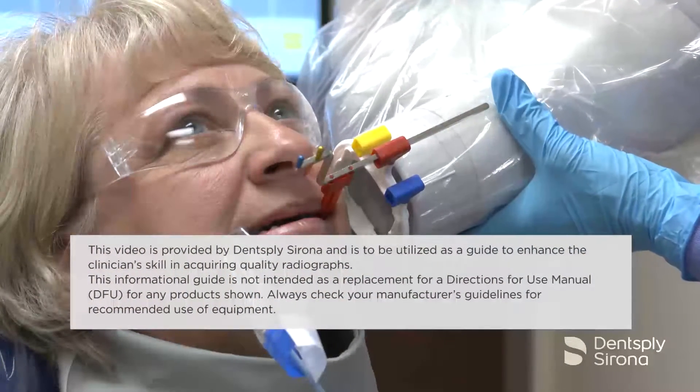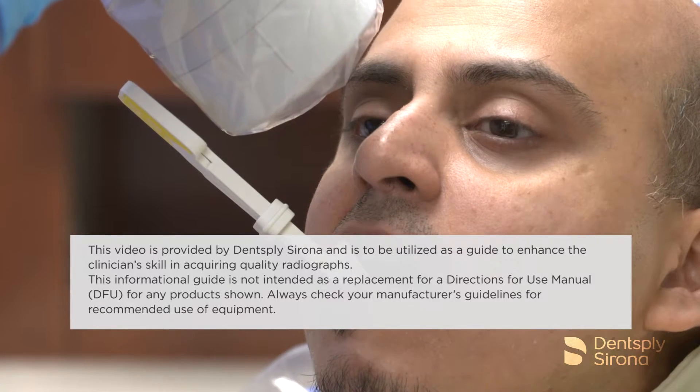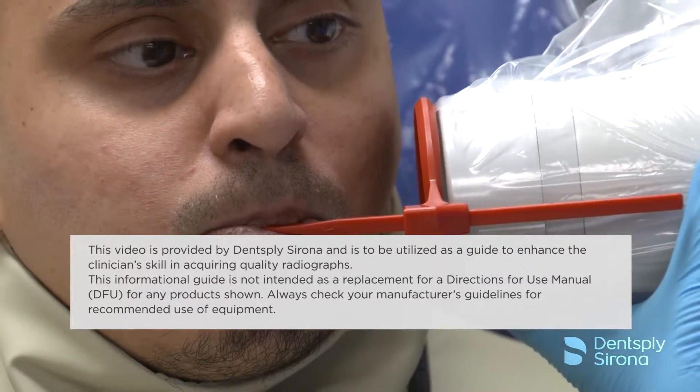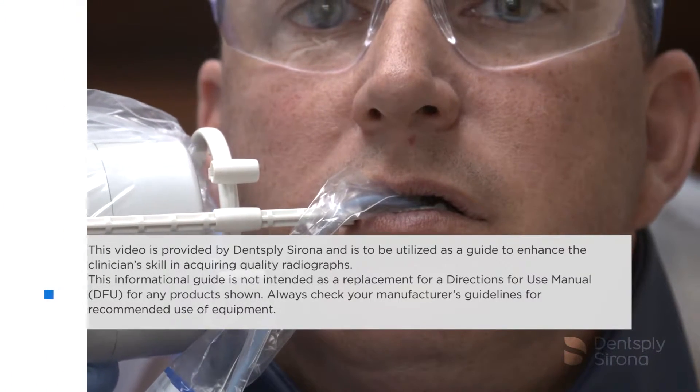This video is provided by Dentsupply Sirona and is to be used as a guide to enhance the clinician's skill in acquiring quality radiographs. This informational guide is not intended as a replacement for the Directions for Use manual for any products shown. Always check your manufacturer's guidelines for recommended use of equipment.